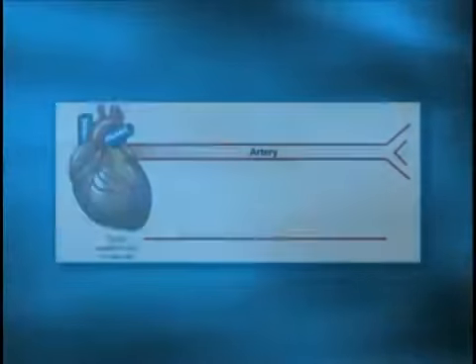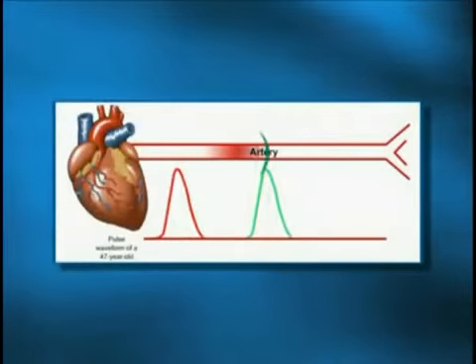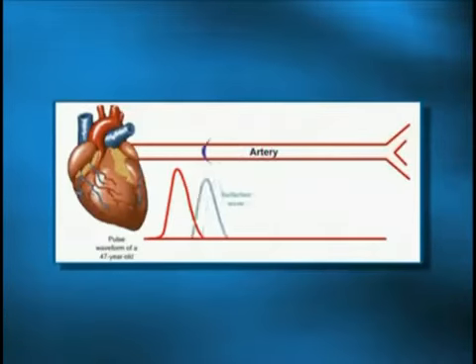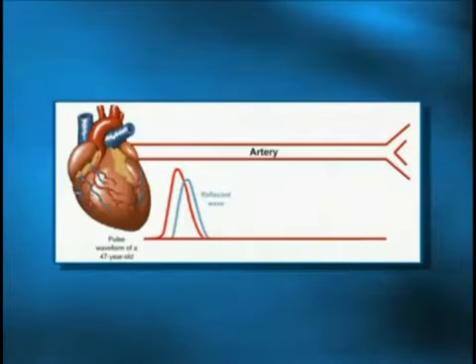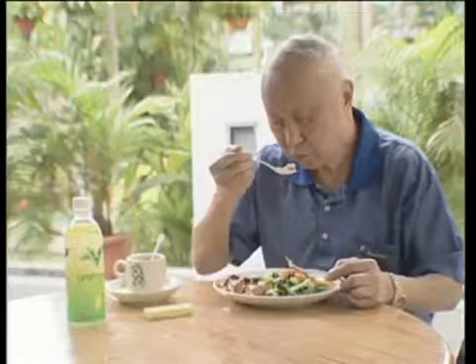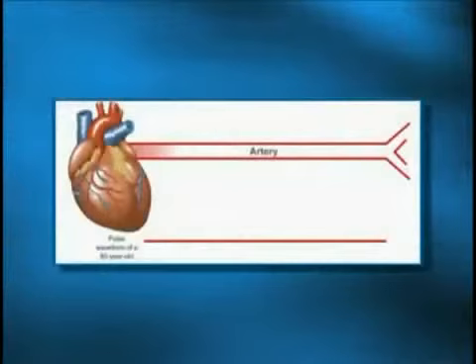But when you are about 40 years old, the vessels get a little bit stiff. When the heart pumps, the wave travels a little too fast. It comes back a little too fast, and it actually enters into the systole. So what you get is actually an extra load for the heart to fight. So you are fighting your oncoming wave. Does the person feel anything? The answer is no.